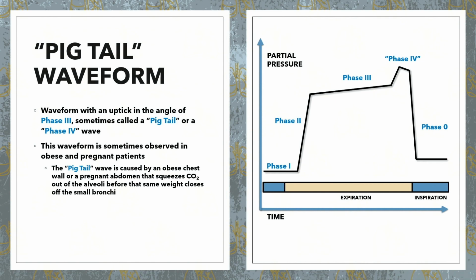and we have our inspiratory phase. And you'll notice too that because you've got a little bit of air still left in the small airways, you have the phenomenon of rebreathing that's occurring. And you can see that here at the return to baseline. You'll notice that it doesn't quite return to the same baseline as before, and that's because there's still a little bit of CO2 in those small airways.